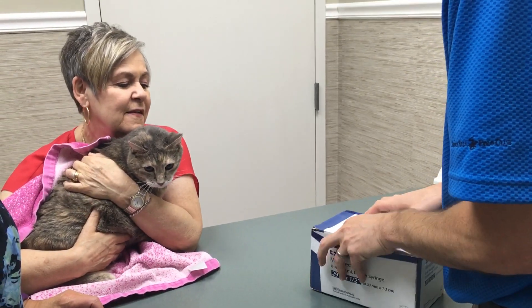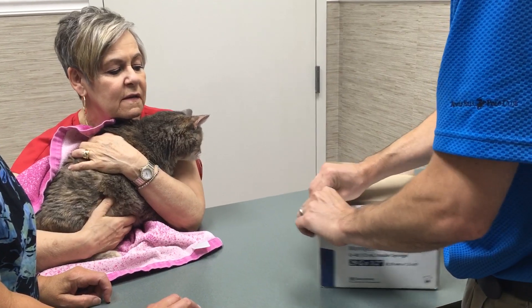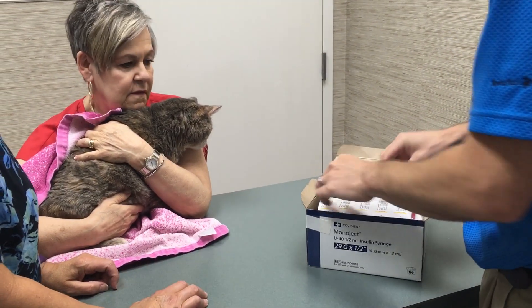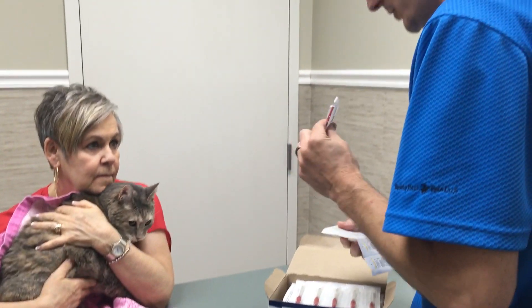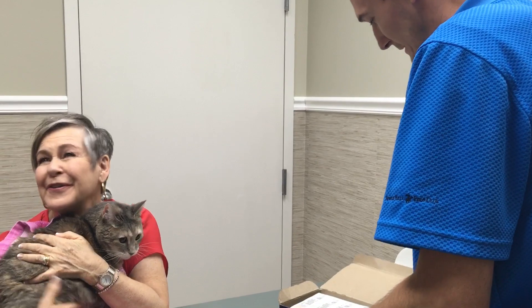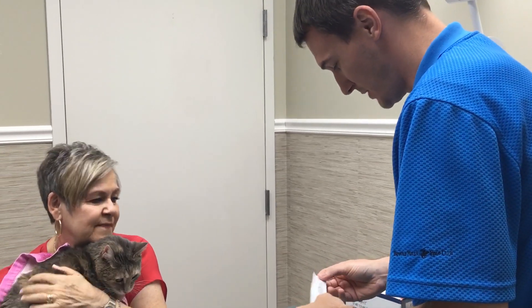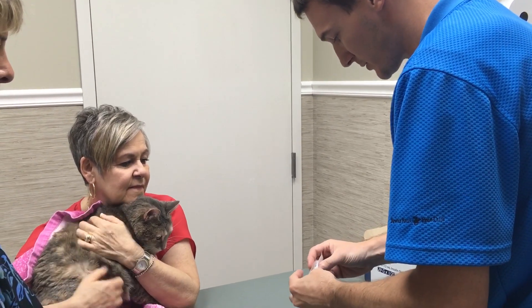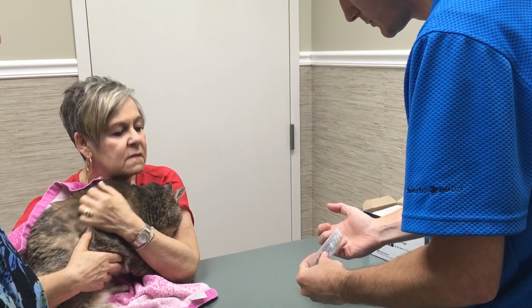So first thing is we are using a veterinary specific insulin. This is a different concentration than human insulin, so we cannot use human insulin syringes. The dose is about two and a half times different, so we do not want to mix them. They are marked on the syringe based on units — 5, 10, 15, 20 — that is how many units.